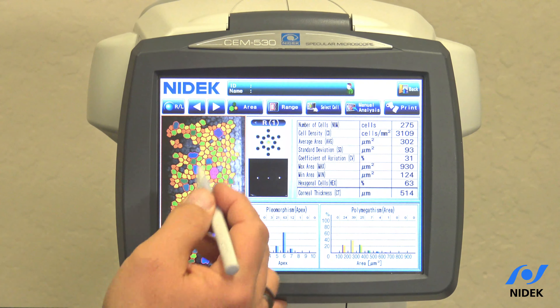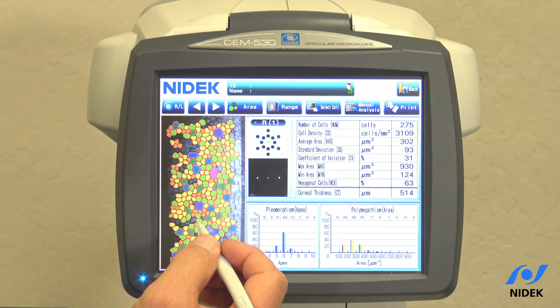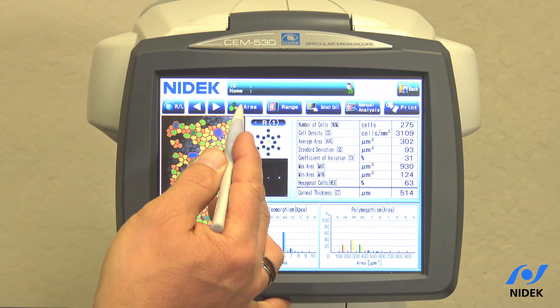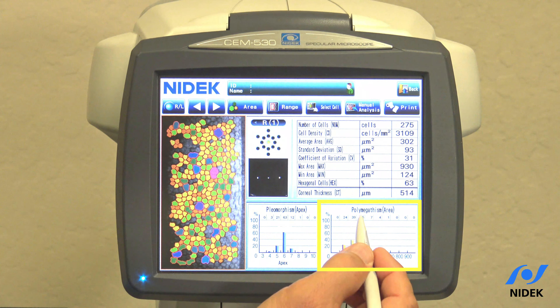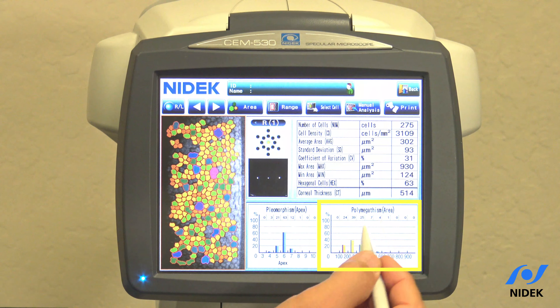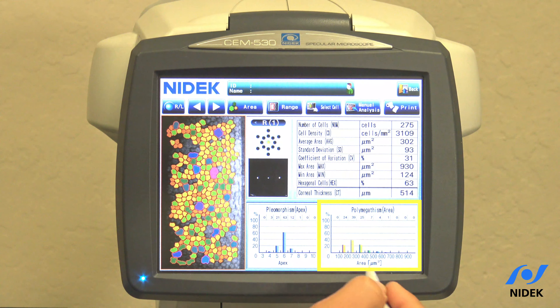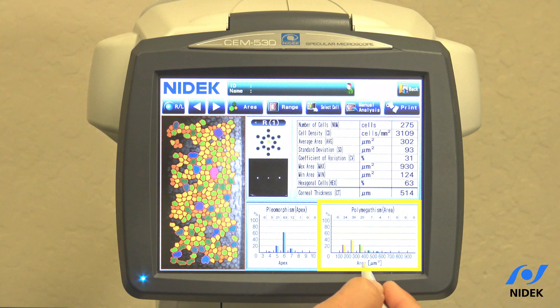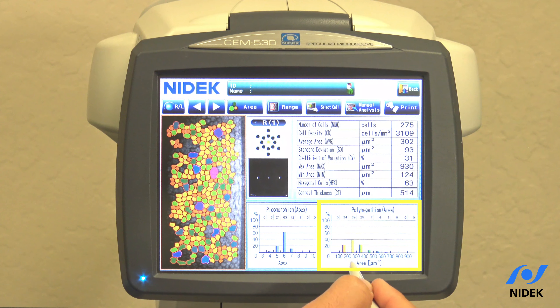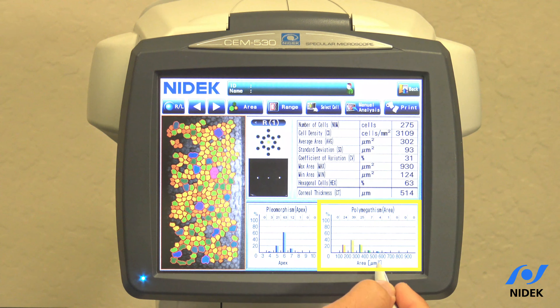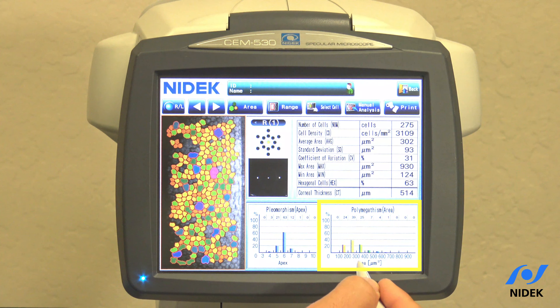As you can see here it's color-coded. This is the area which is our polymegethism area. It's color-coded here in the percentage of the most cells that are determined by the size.